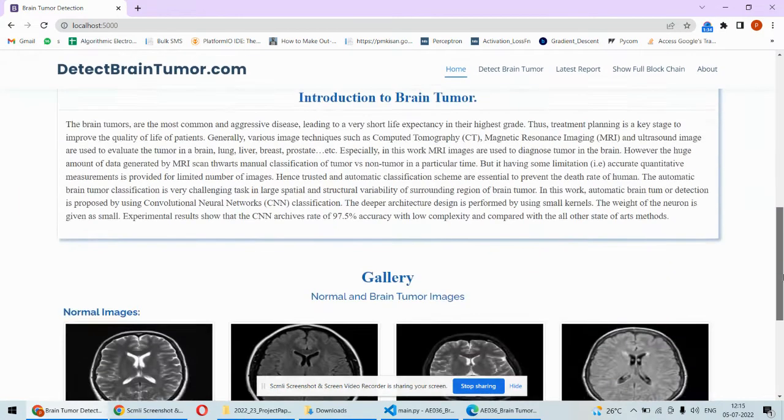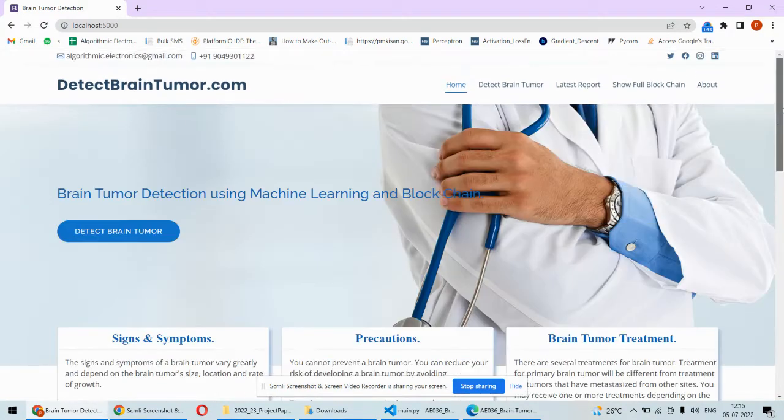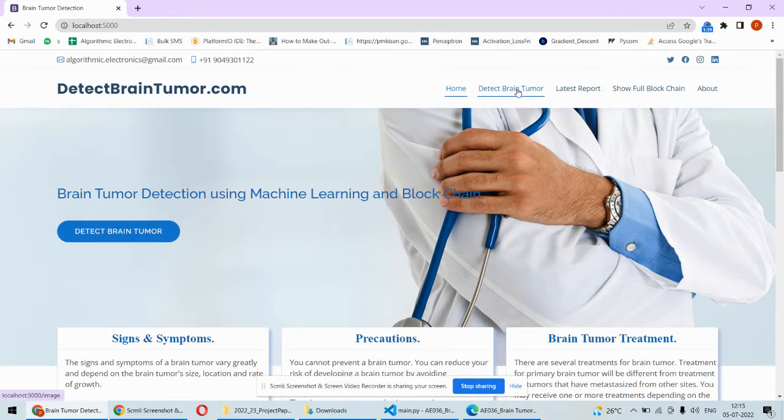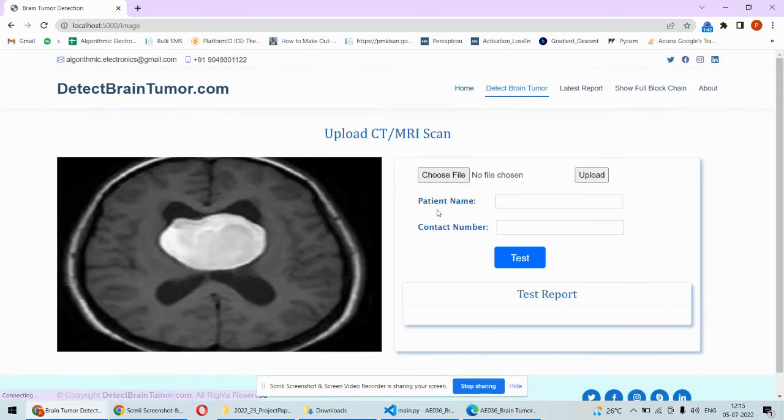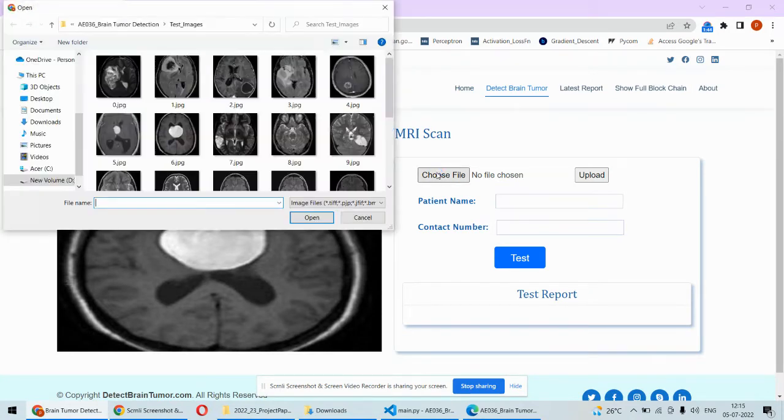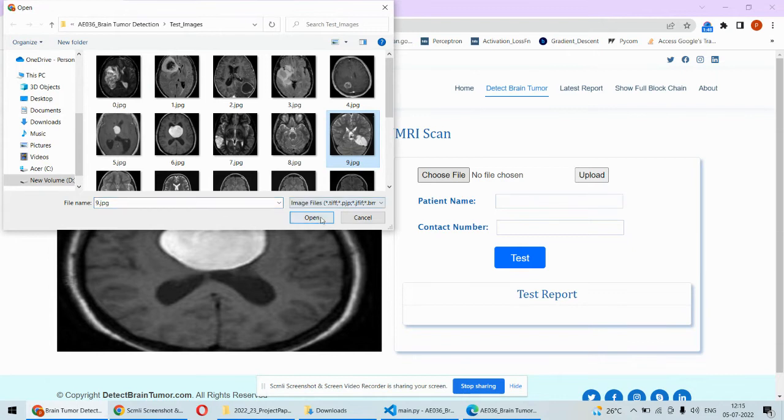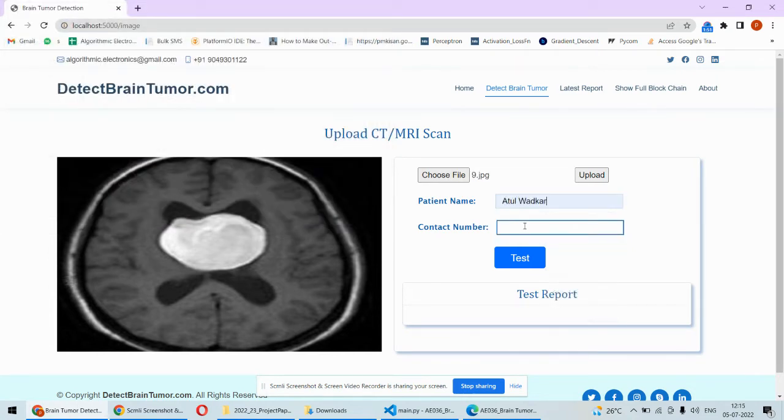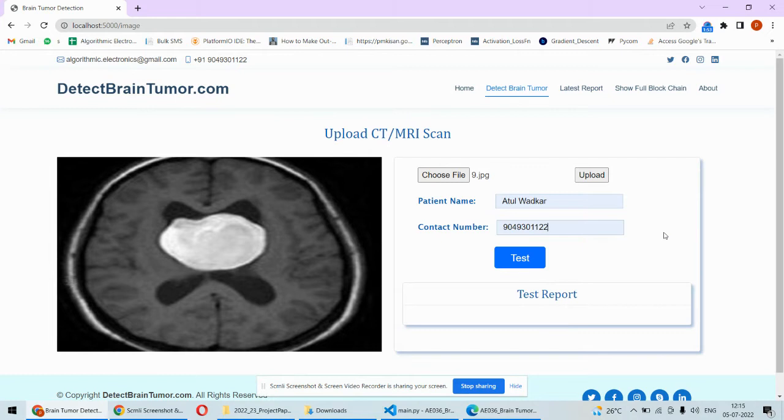The main important part of this project is the detect brain tumor. You may click from here also. So here you need to choose the file. For example I will pick this file and then here the patient's name and his contact number is to be uploaded.